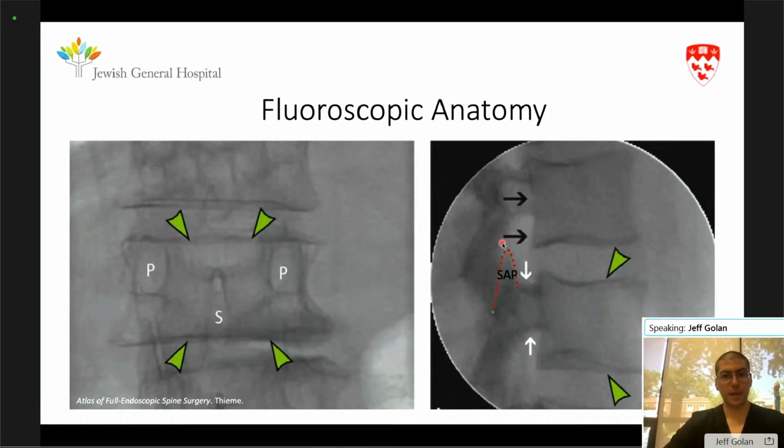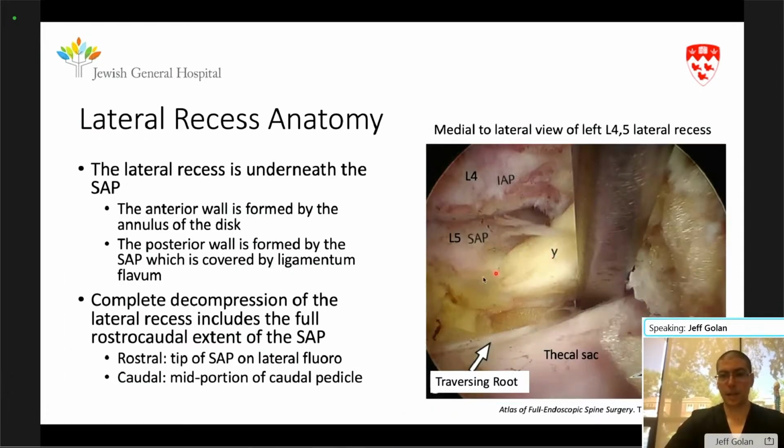The medial and lateral extent of the lateral recess decompression is a little bit trickier. It is something that has to be evaluated one patient at a time by looking at the MRI and appreciating where the lateral recess ends and where the nerve is being impinged. But almost always, the medial portion of the descending facet process is resected, the ascending facet process is visualized, as you see here, and the yellow ligament is resected off the medial edge of the ascending facet process.